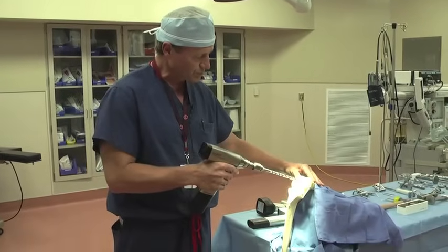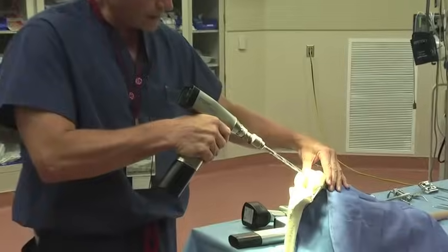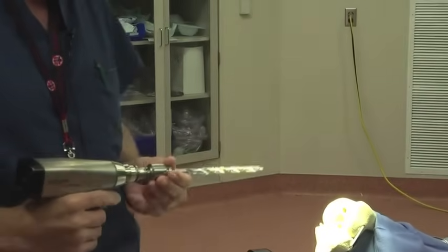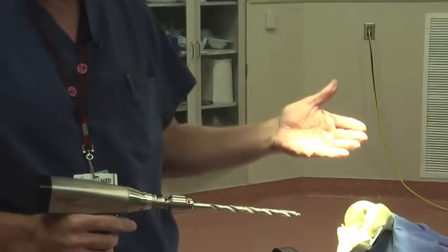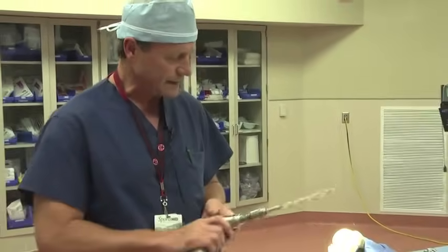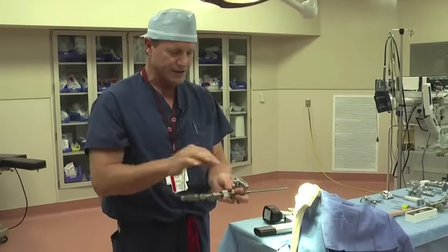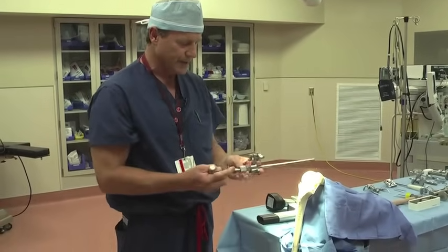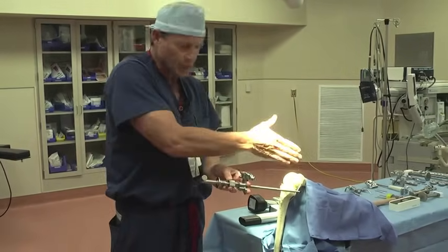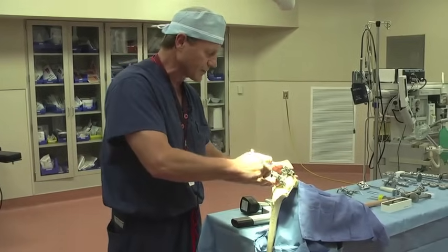We'll next use a drill to make a little pilot hole into the end of the femur and drill that down into the femoral canal. The reason we do that is we need a guide to give us our alignment when we put that first jig on. We'll place in an alignment rod that has a cutting block attached to it, and it sets the angle for our cut — normally a five-degree cut on this distal femur, unless something dictates otherwise.